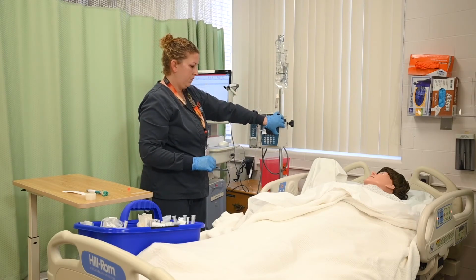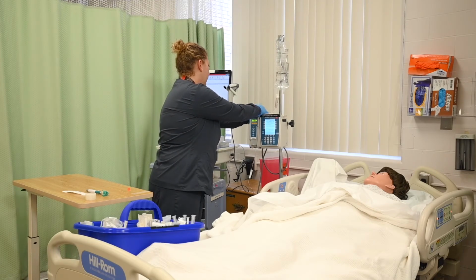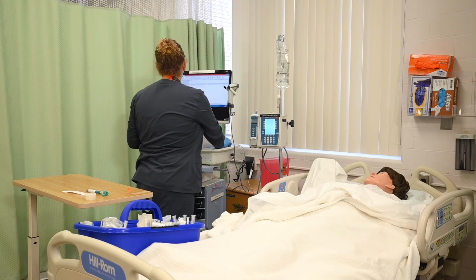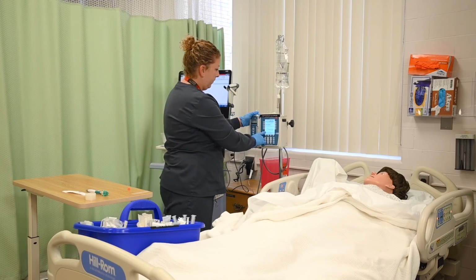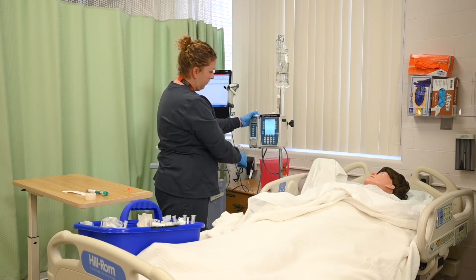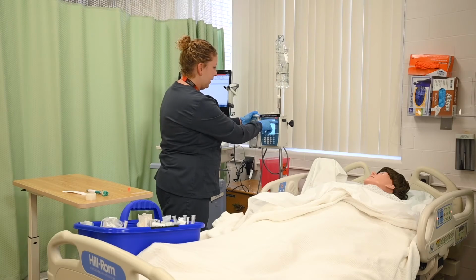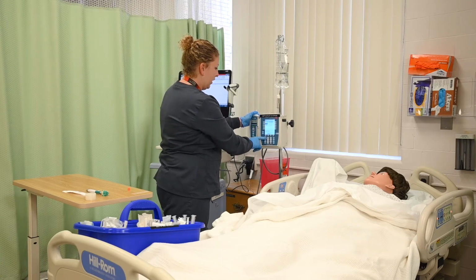Okay. Set the correct rate and volume to be infused on the infusion pump. Verify with the NUR. Select channel, guardrail IV fluid, 0.9 normal saline. Is this correct? Yes. Rate, 100 mLs per hour. Volume to be infused, I'm going to enter 950 mLs.